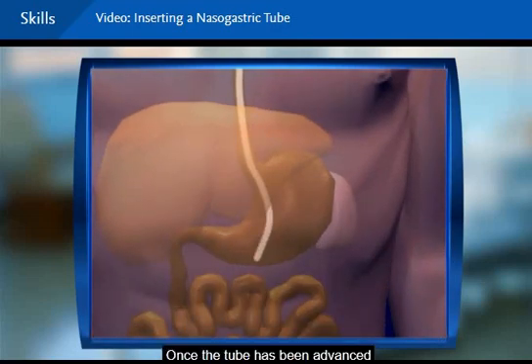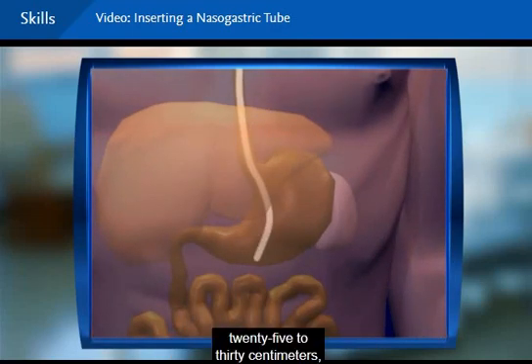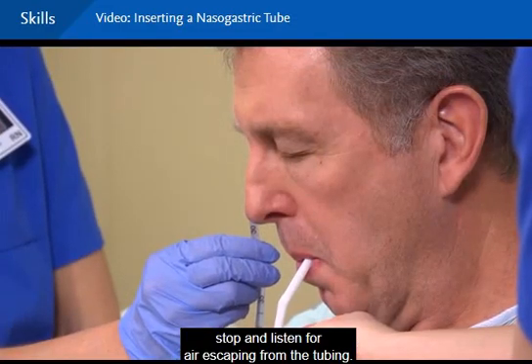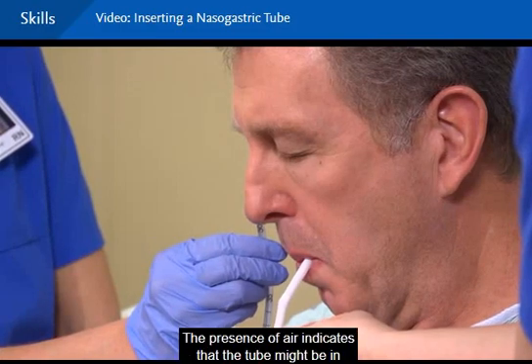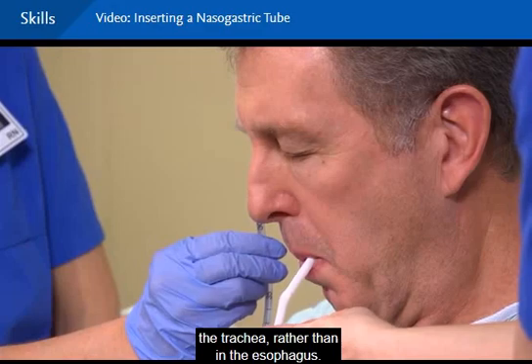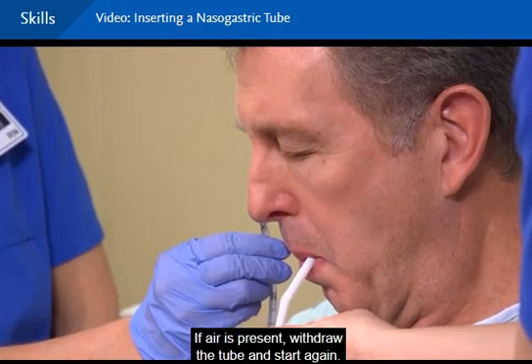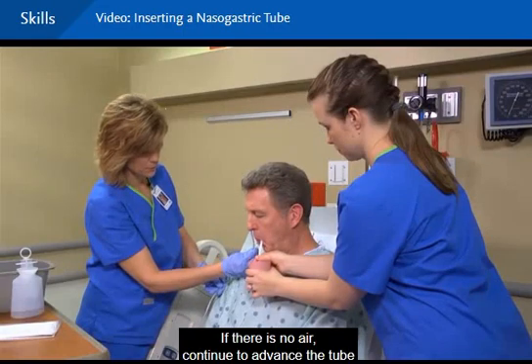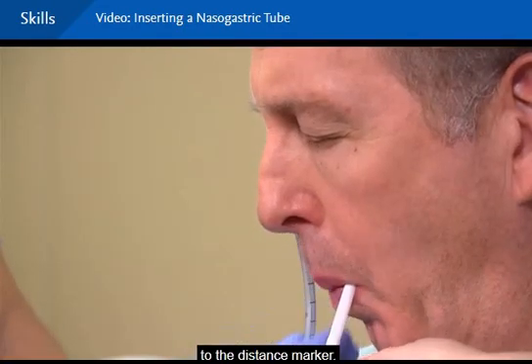Once the tube has been advanced 25 to 30 centimeters, stop and listen for air escaping from the tubing. The presence of air indicates that the tube might be in the trachea rather than in the esophagus. If air is present, withdraw the tube and start again. If there is no air, continue to advance the tube to the distance marker.